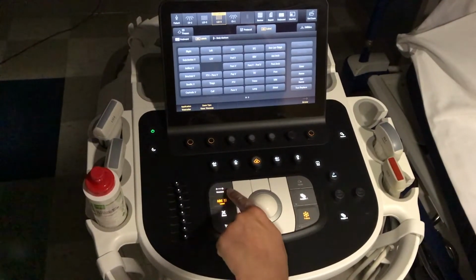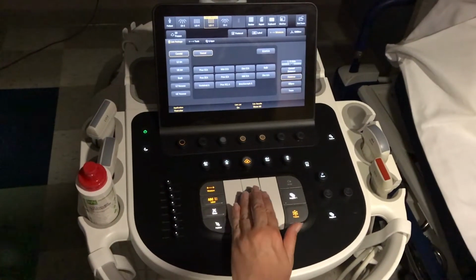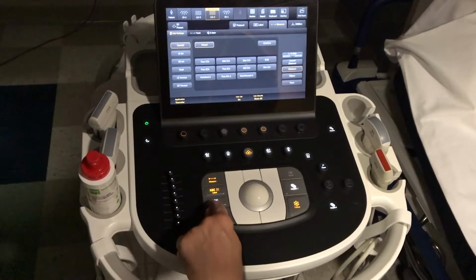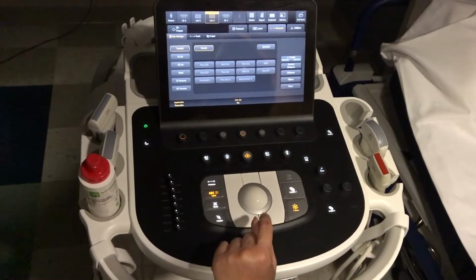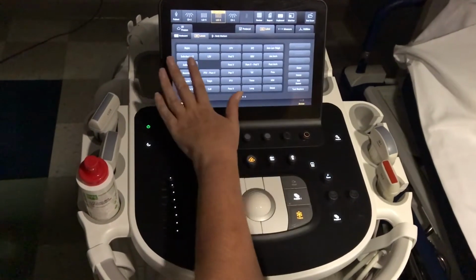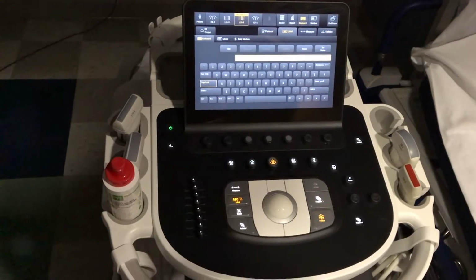If you want to measure something, this measurement button here will give you calipers to measure. You can select it again, move that around, and you can image store to acquire that documentation, or again, you can use the erase option to erase all of your measurements. First push erases the last, and then the next erase erases the first one. And again, annotation is by hitting the ABC label here. You can use the automatic on the touch screen, or you can go to keyboard, use this keyboard, or this keyboard if you prefer.